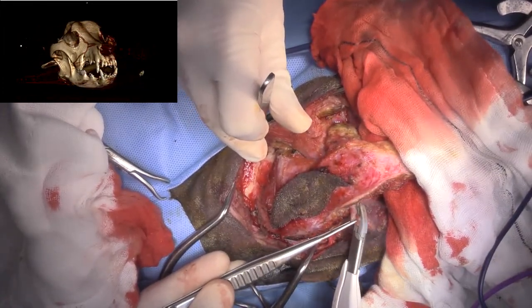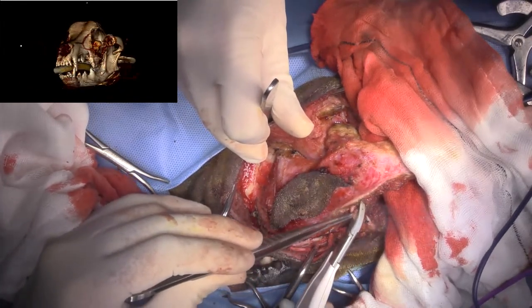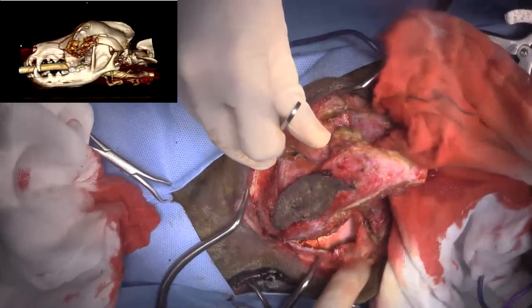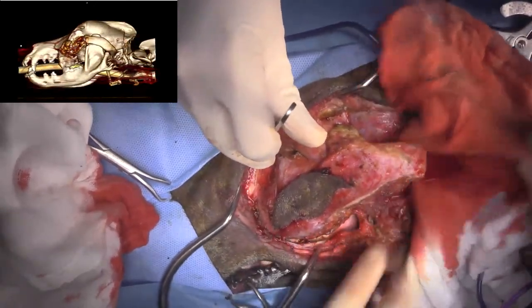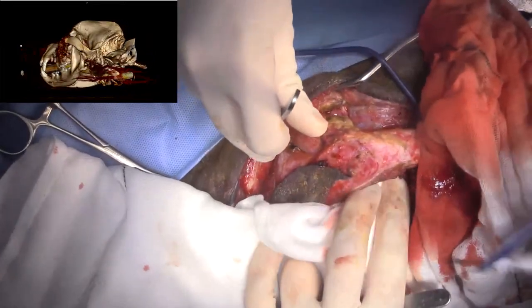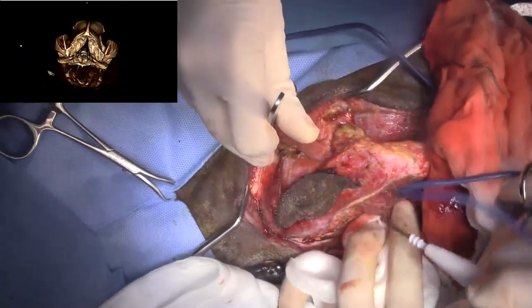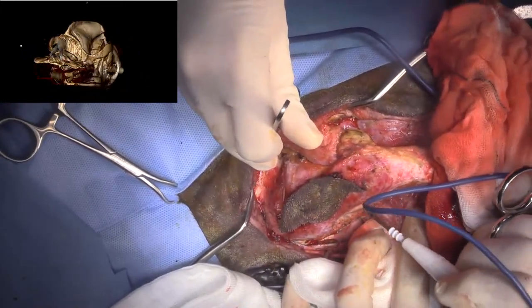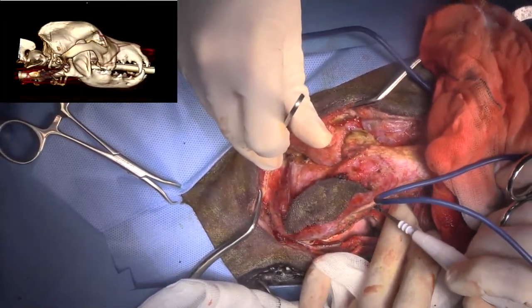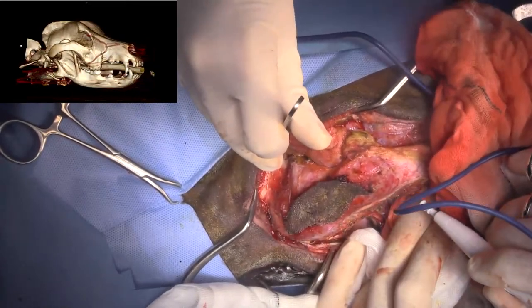Another question. Any important steps before transecting nerves besides the anesthetic infiltration? Well, mainly make sure that you can sacrifice them, that they're not something critical and important, and then just infiltrating with mepivacaine. And often, as we're aware, nerve bundles travel with vessels, so just be aware that when you cut them, you could get into some bleeding as well.